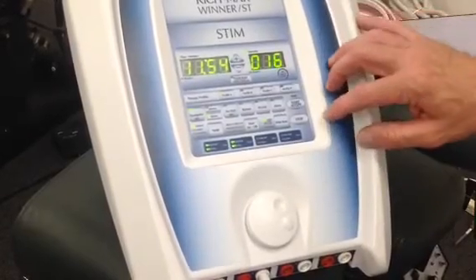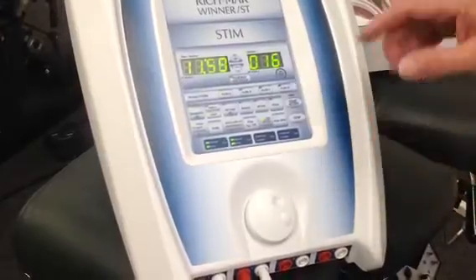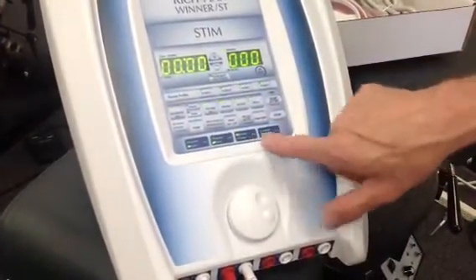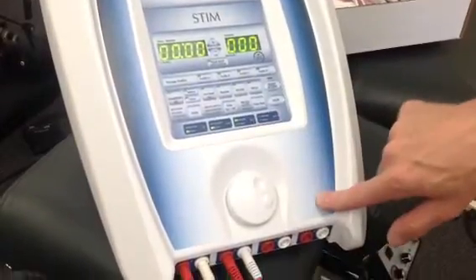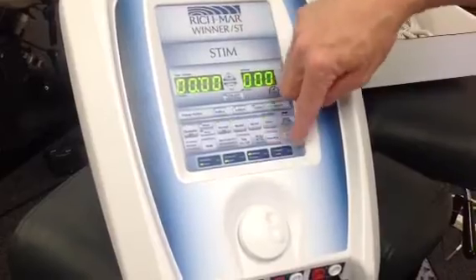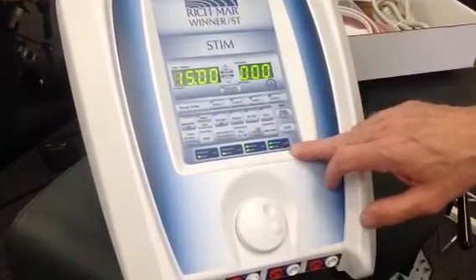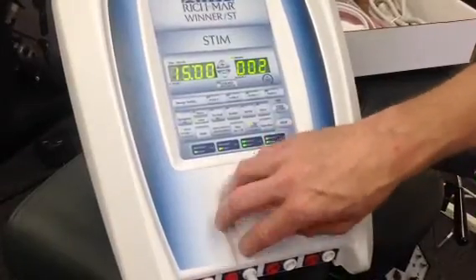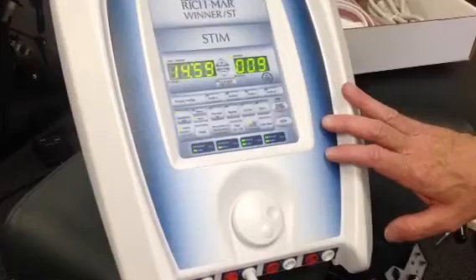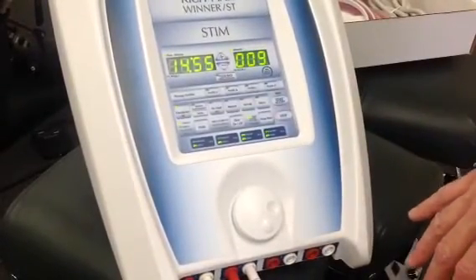Okay? So now, another patient walks in, and all you have to do is select one of your 2 open channels, 3 and 4, and once we hit quadrupolar again, it's going to grab both channels, because quadrupolar requires both channels. And we're going to turn up our intensity again on patient B and hit the stop button, and now we're running on patient B.